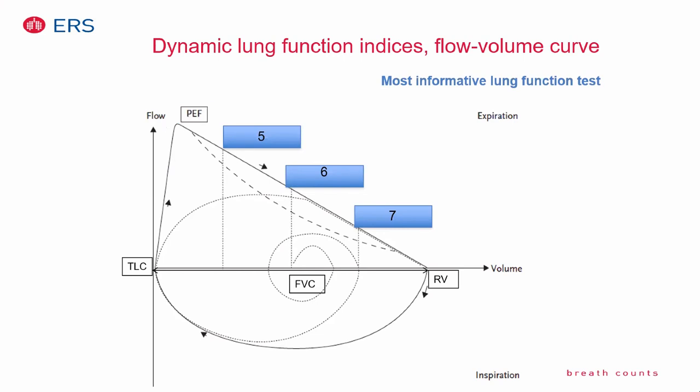So you have the peak expiratory flow, the maximal flow that you have, and then also the maximal flow when still 75% of your volume is in the lung, or here when half of the volume is in your lungs, or here the flow where 25% of the volume is still in your lungs. So for the MEF50, you take here the half of your volume, you put a line, and you see here the maximal flow. In the US, they use a little bit different nomenclature. They say the forced expiratory flow here when 25% of the air has been expired, 50% or 75%.